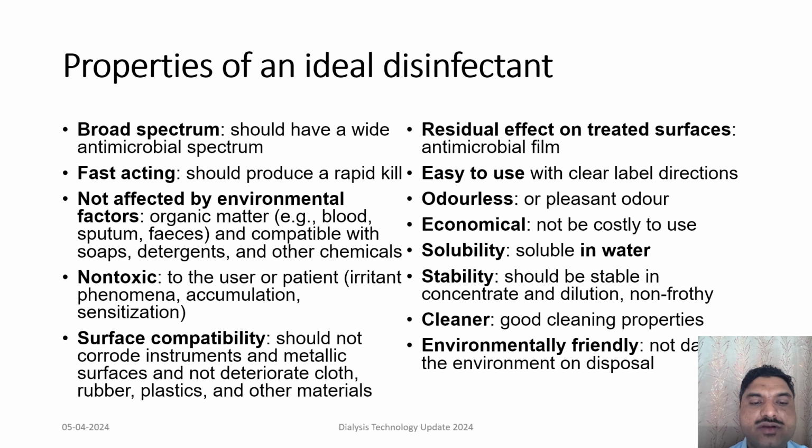They should not be toxic to the patient or the user, so that they shouldn't cause any irritant action, accumulation or sensitization actions. They should be surface compatible, so that they should not corrode any instrument or any metallic surface, and should not deteriorate any clothes, rubber, plastic or any other material that is used in the dialysis machine.